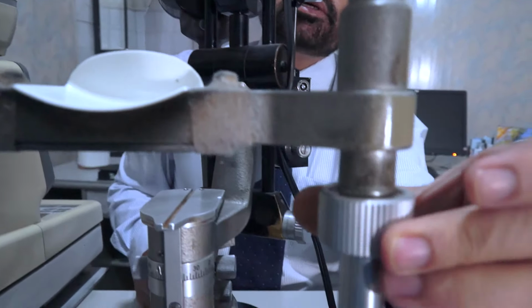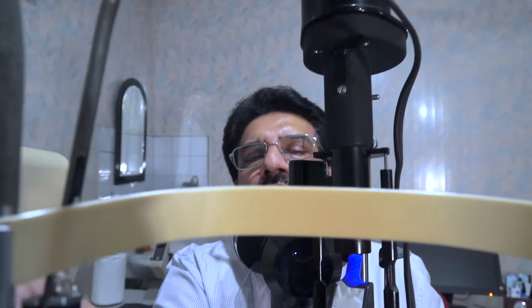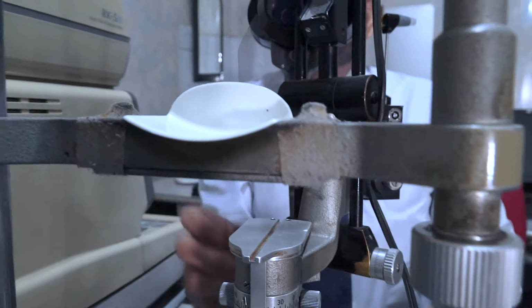There is another one. This is called a fixation target. It has got illumination in it, and we can use this fixation target sometimes to show the patient this fixation and to work on the other eye while he is looking at this with the one eye.